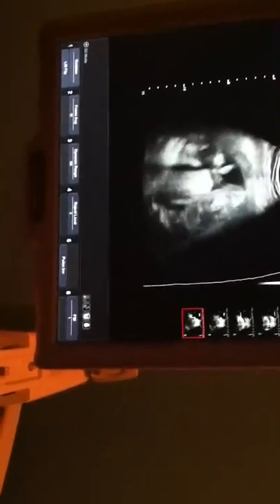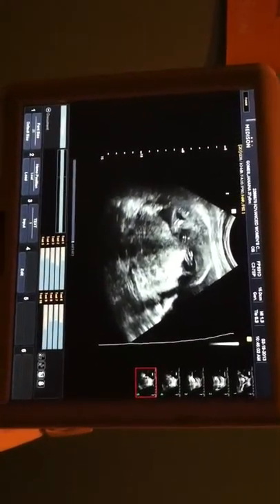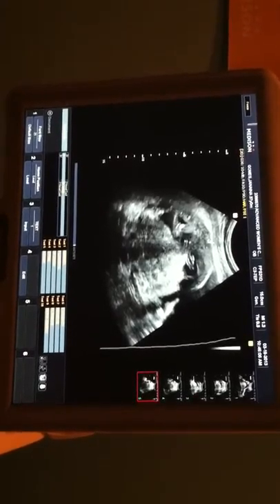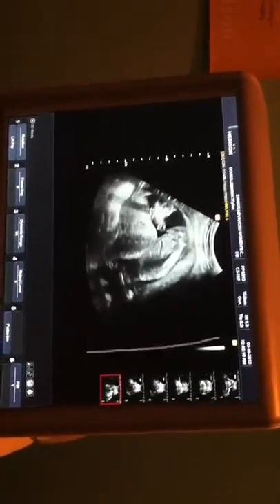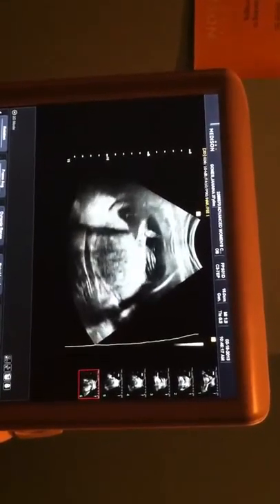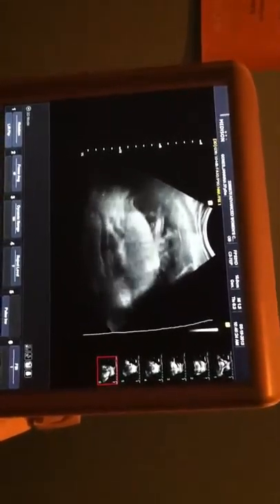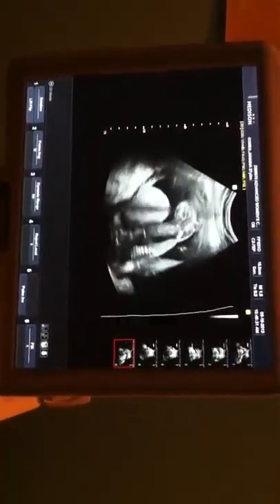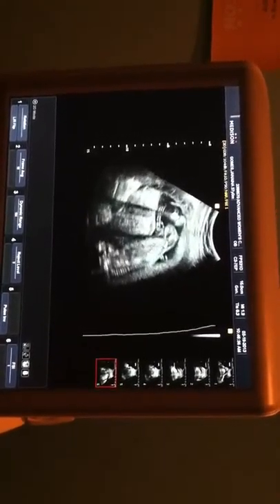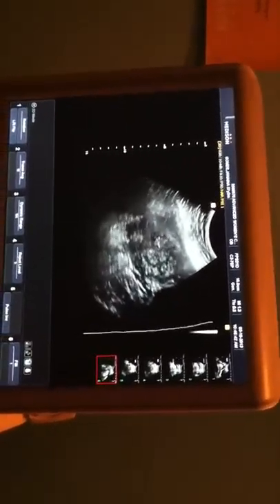Let's get a few other things out of the way, and then we'll do our measurements, and then hopefully he'll wake up and start moving. Taking a nap right now. This is a little piece of umbilical cord. He's having a good nap in there. He's moving a little bit, stretching around. Put his toes on it there, he's moving.